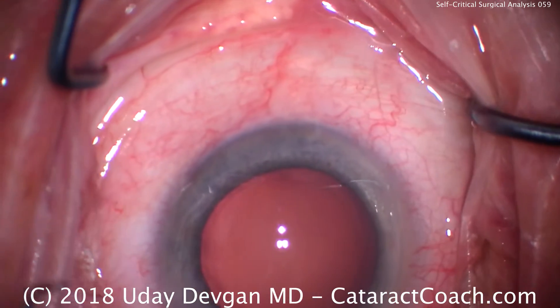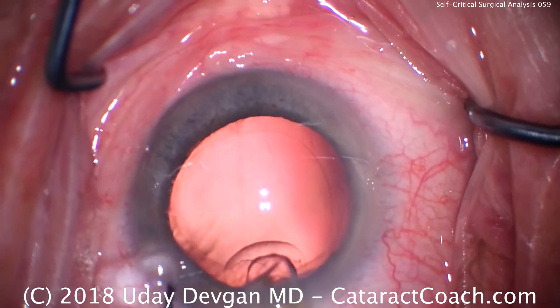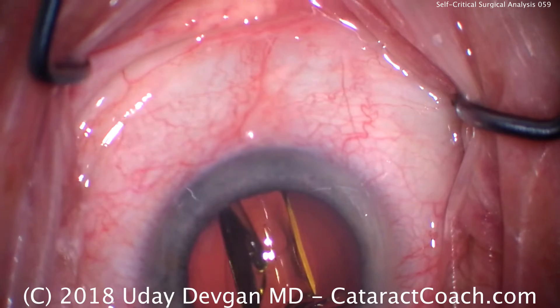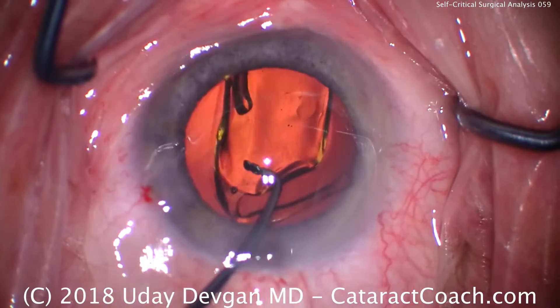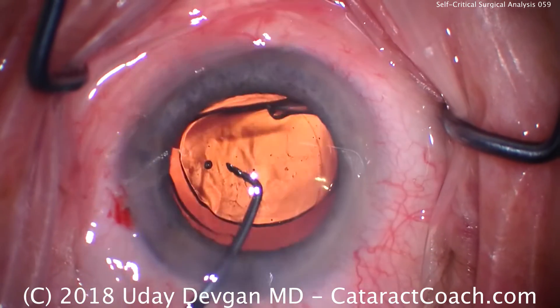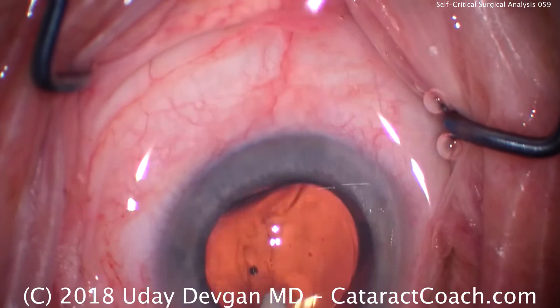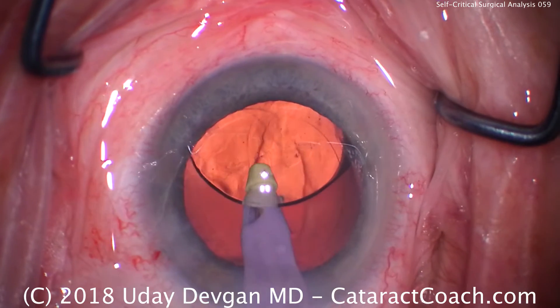Now we'll implant the lens. Here comes the lens — a single-piece acrylic lens loaded by my technician. We realize that even the technician can learn. See how that trailing haptic of the lens is less than ideal? So we'll rotate into position and let it all open up. There's no downside in terms of optical quality for the patient — the lens is still fine, it just wasn't loaded ideally. Go under the lens to remove viscoelastic and finish up the case as usual.